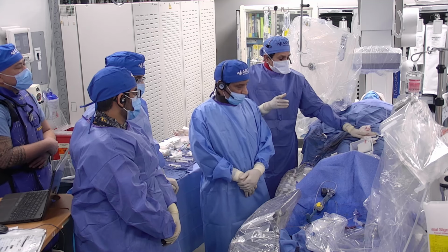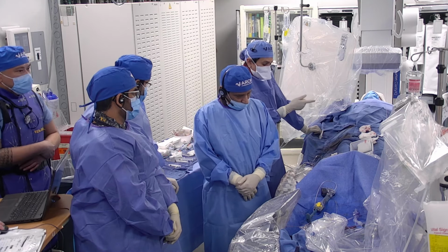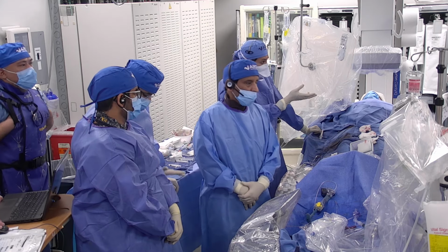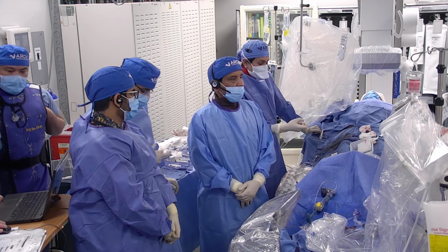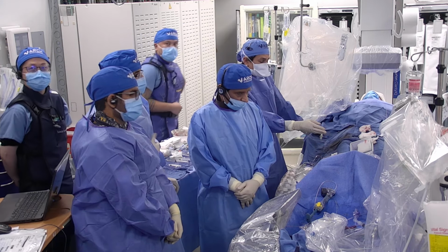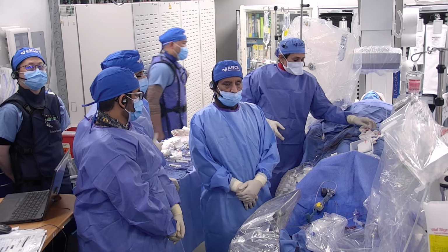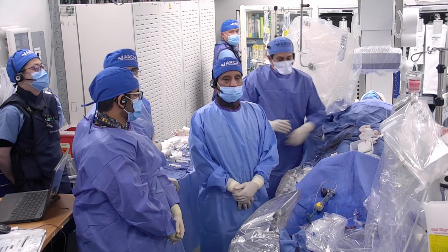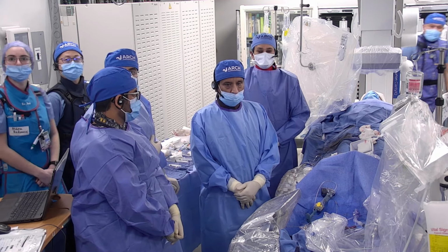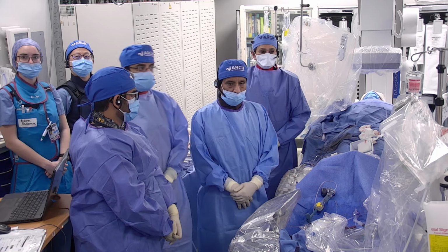In our app called TAVR Cath Aid, we actually have animation of how to engage and how to take it out. In this situation where you can disengage from the left main, and then you can use your J-wire. So get your J-wire in through the cage first, and then get the guide out slowly, like you were mentioning, so that dislodgement of the valve does not happen. Yeah, and that's what I was getting at. So thank you very much for making that point, because at the end of a beautiful case, you could mess it up just by taking the guide out.